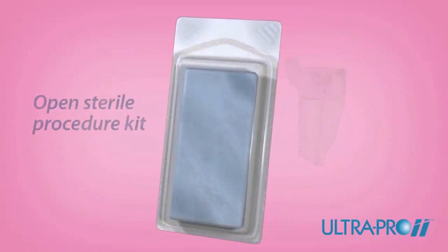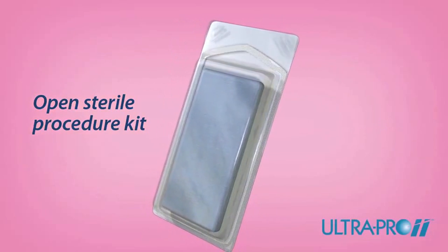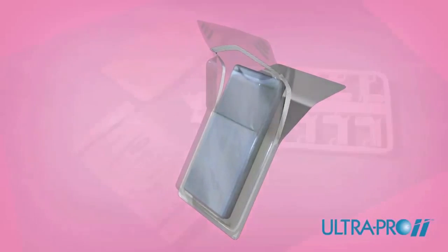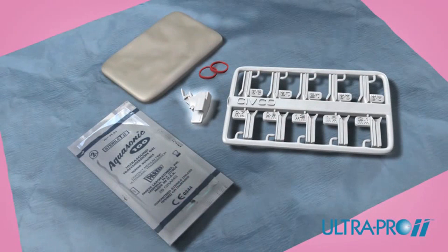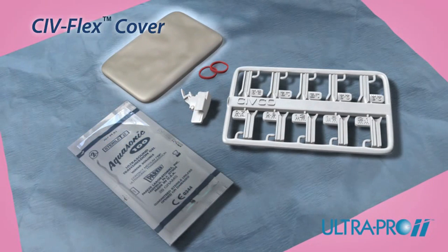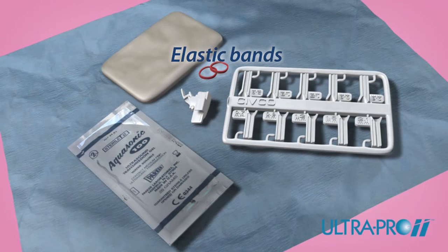Each needle guide is conveniently packaged in a sterile procedure kit. Using proper sterile technique, open the UltraPro 2 needle guide procedure kit. Inside, you'll find an UltraPro 2 needle guide and needle guide insert, CivFlex transducer cover, gel packet and colored elastic bands.